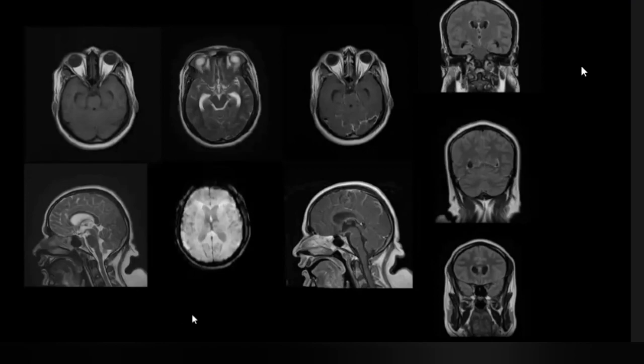This was a young patient who presented with signs of meningeal irritation. I just wanted to highlight in these images that you have to look at the post-contrast FLAIR images, and on post-contrast and plain FLAIR images, we have to look at the leptomeninges. If there are bright signals along the leptomeninges, they represent leptomeningeal enhancement. In cases of meningitis, here we can see basal meningeal enhancement along the anterior aspect of the pons and in the basal cisterns. It is very evident.